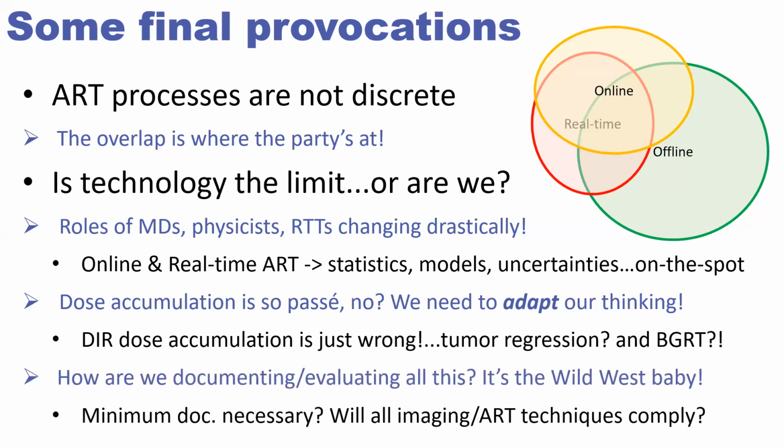And lastly, how are we documenting all this? Everybody's doing different things here. If we're trying to evaluate, we have to somehow figure out how an MRI LINAC can be evaluated in the same aspects that a RadExec is. That's everything.